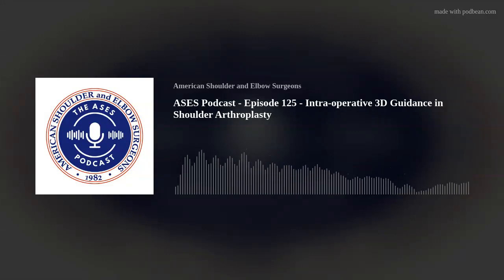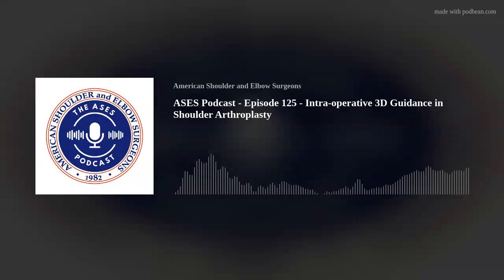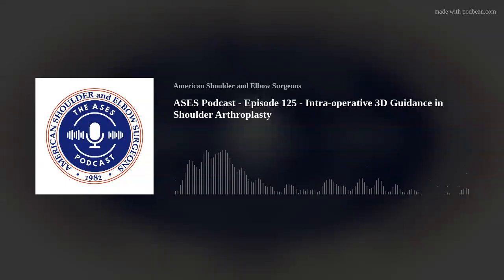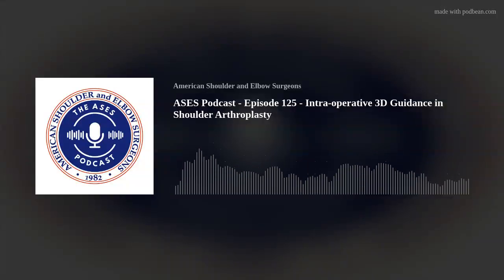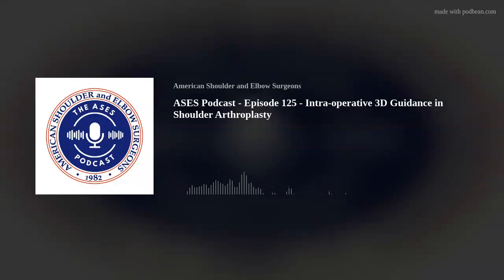Incredibly thoughtful response, and I love the way you frame that. You bring in this concept of precision, right? Precision and accuracy, and then also, where the best host bone is. I think as we talk about PSI guides, it's important to articulate, is this a reusable one that can be customized and reused for repeated cases, or is it a 3D printed guide as has been described for several cases? Maybe Tom, if I could go over to you next and you can walk us through what you're routinely using as your form of guidance.